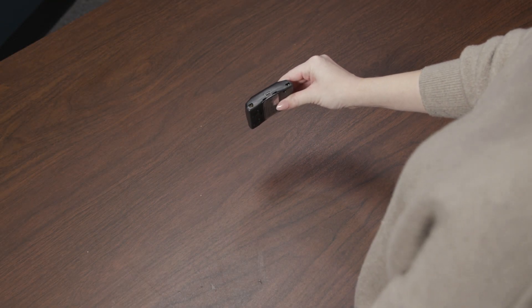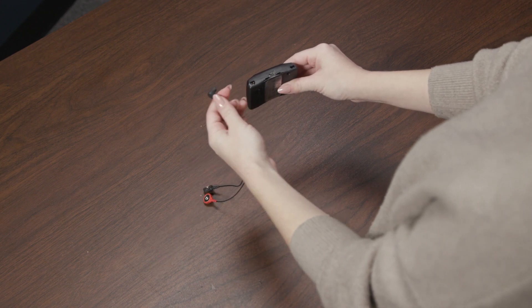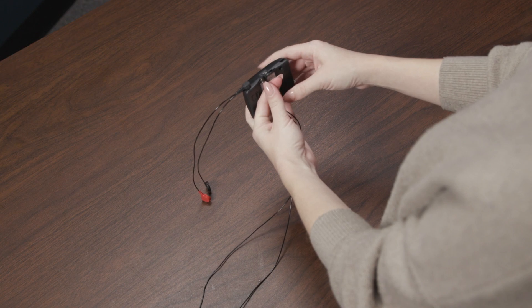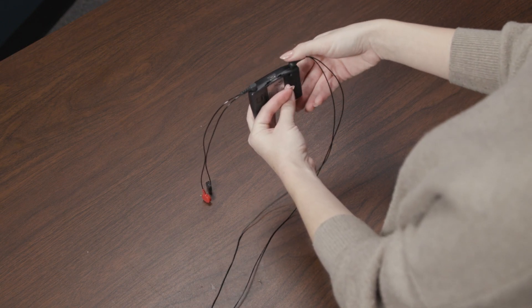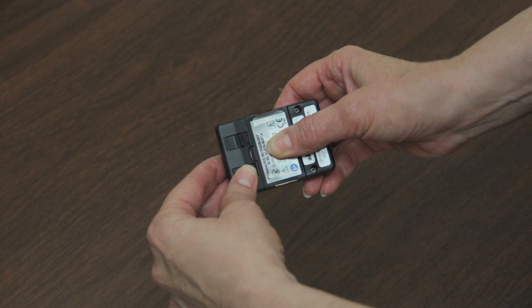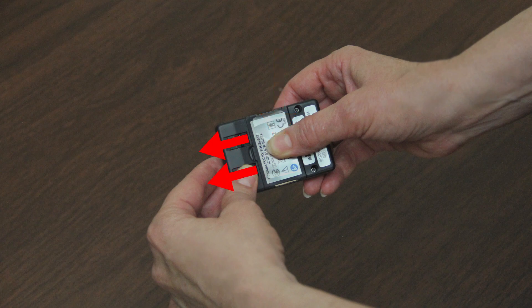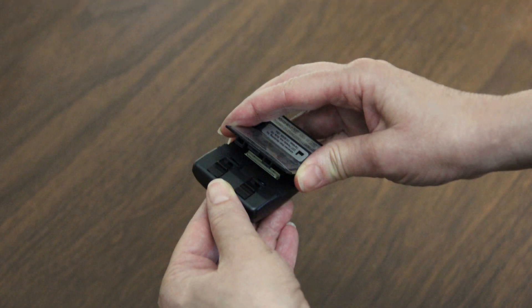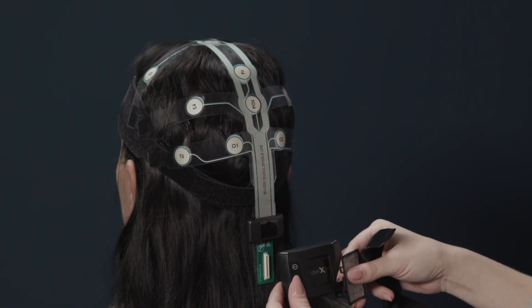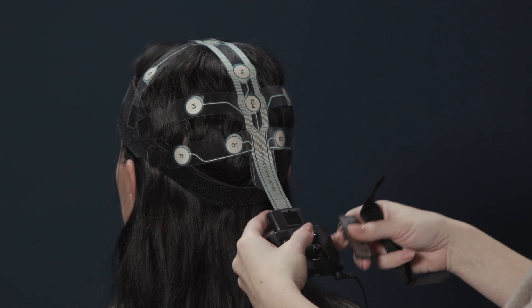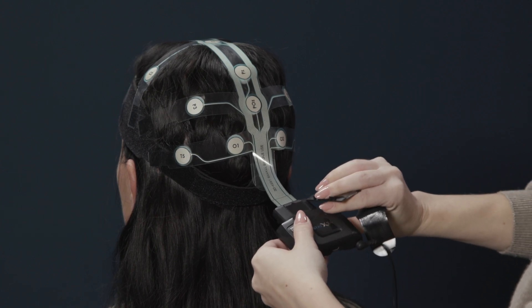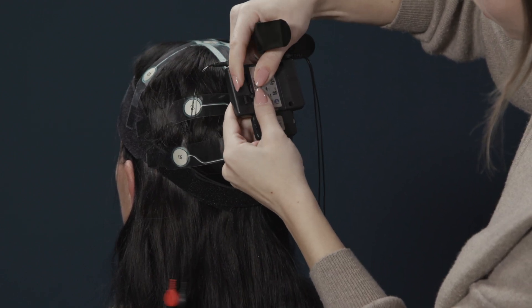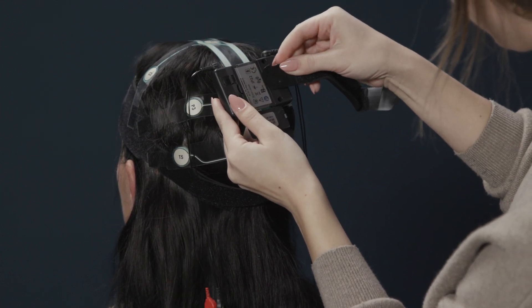If the three-pin cables are not already connected to the headset, connect them to the three-pin connector. If you are using the ECG leads and the two-pin cables are not already connected to the headset, connect them to the two-pin connector opposite the three-pin connector. You are now ready to connect the headset. With the headset label side down in your hand, press your thumb in the middle of the door. Then slide open the two latches and remove the door. Make sure the slide locks are fully open before removing the door or it may cause damage to the locks. Hold the headset with the STAT X24 label facing you. Align the adapter board with the underside of the headset. Carefully and firmly connect the two pieces. Flip the headset over. Replace the door. Press in the center of the door and slide the locks closed.